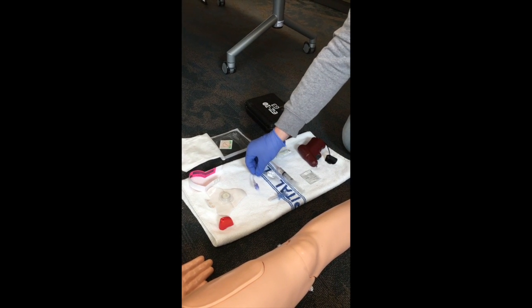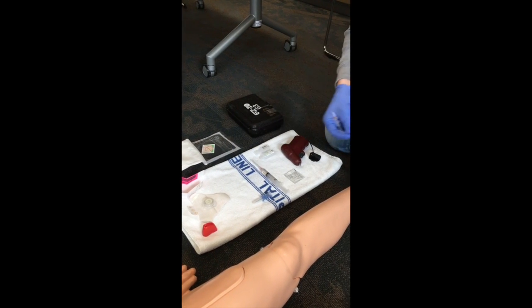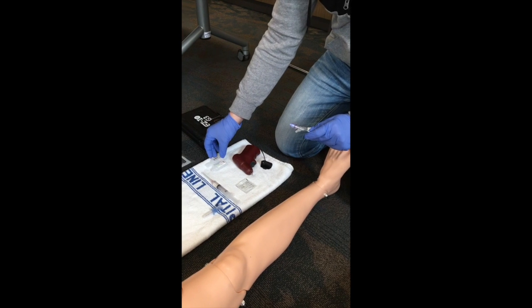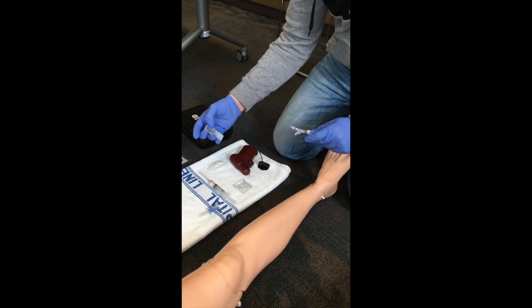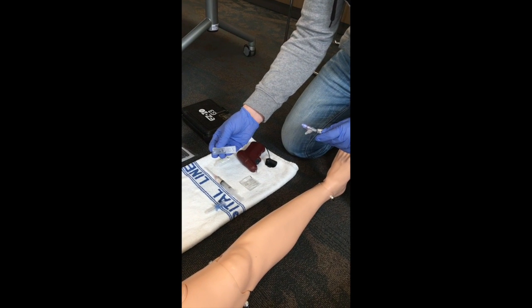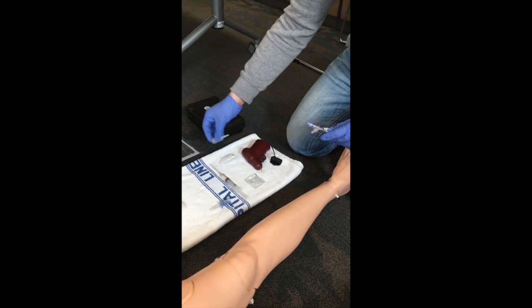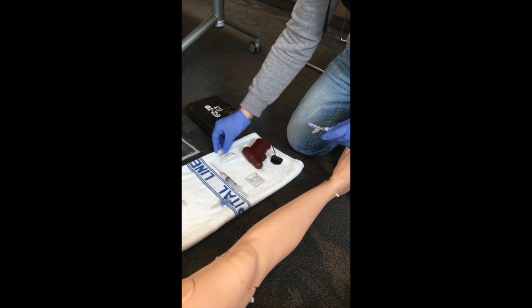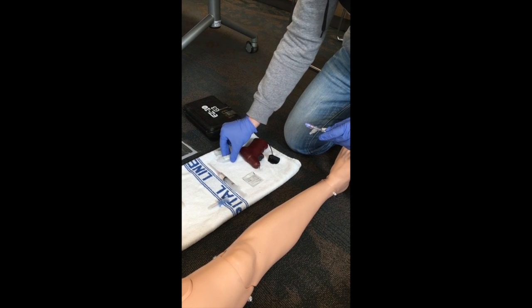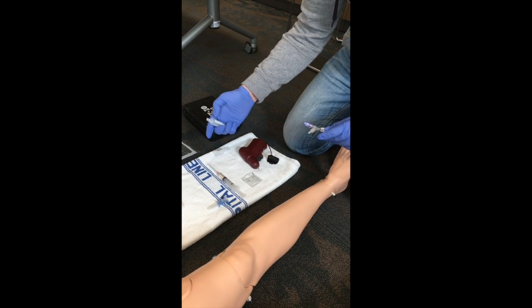As discussed earlier, in a conscious patient 1% lignocaine can be used to prime the giving set. In all other circumstances, such as cardiac arrest, normal saline is entirely appropriate.